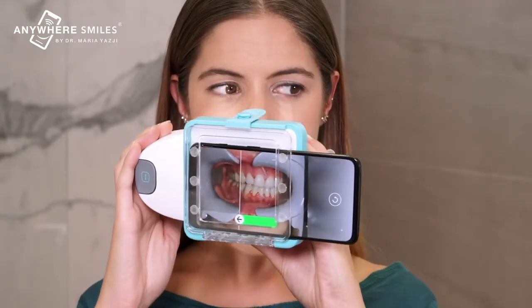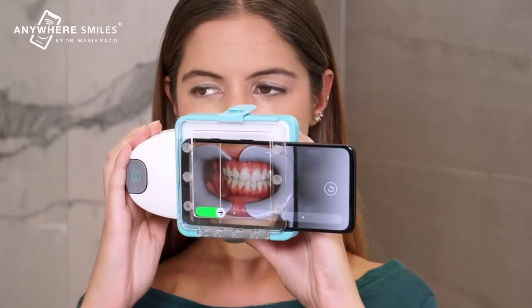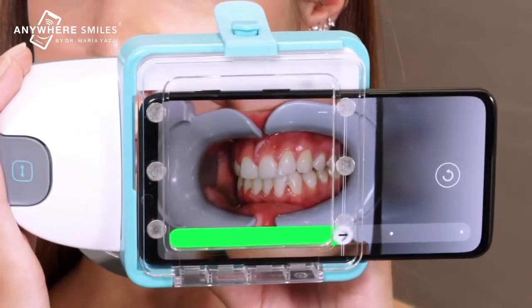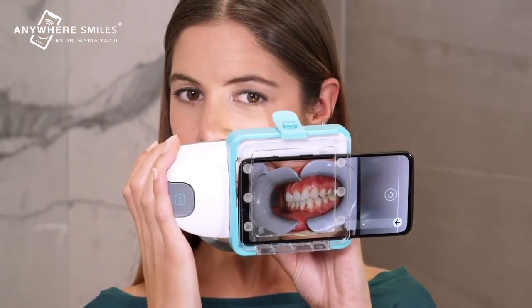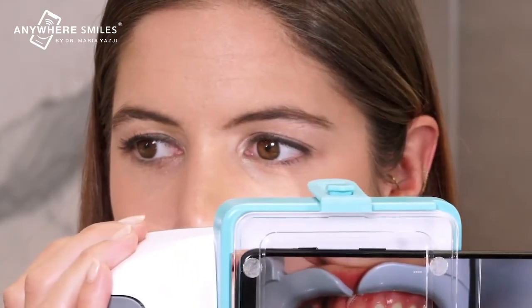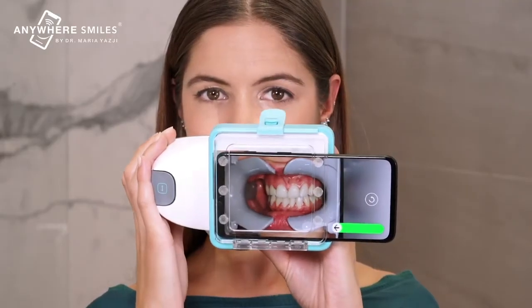Shift the ScanBox to one side. Now shift the ScanBox to the other side. Make sure you move the ScanBox at the same rate as the progress bar. Scan all the way to the side to make sure your back teeth are well seen. You can also turn your head slightly in the opposite direction if that is easier. Back to the center.